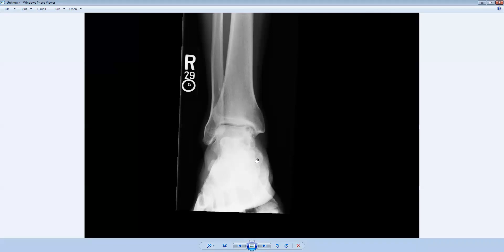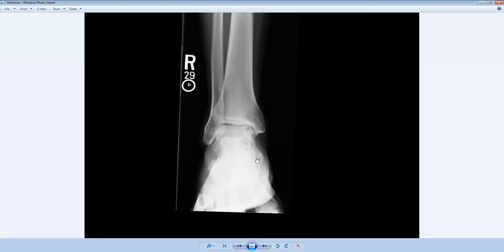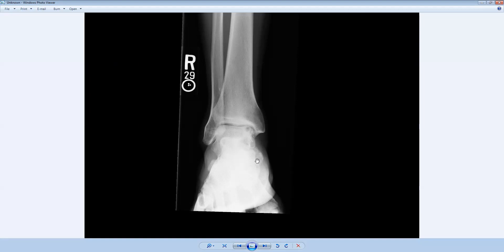We may think that a very common scenario would be, could this represent a geode or a subchondral cyst in the setting of osteoarthritis or degenerative joint disease? That would be a very common reason to have a subchondral lucency at a joint space. However, this patient is very young, a 23-year-old athlete.